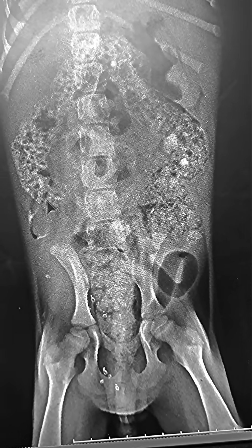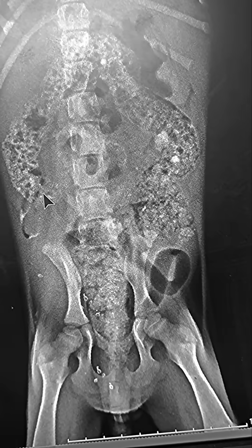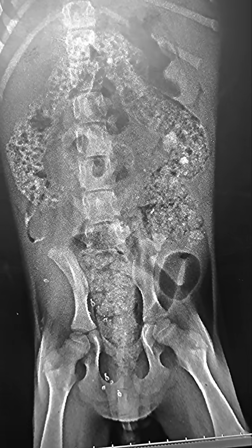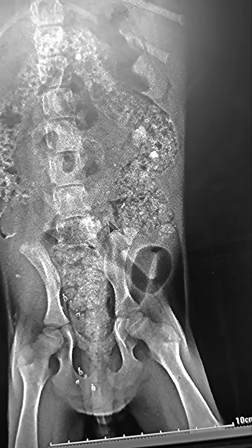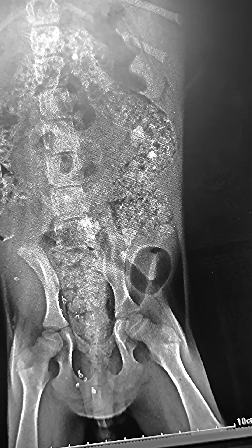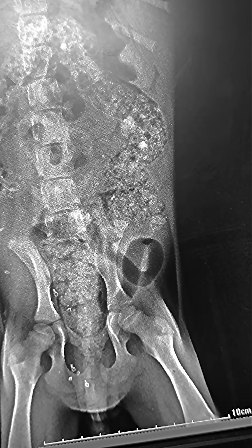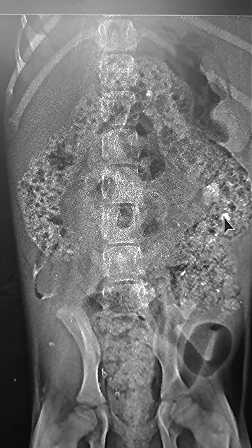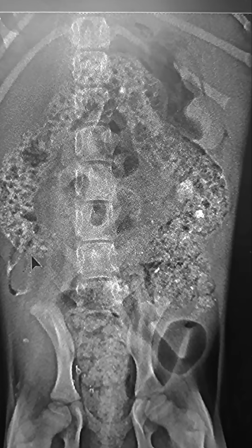If you see here, from the cecum, even gas is not present in the cecum. From here is the ascending colon, this one is the transverse colon, and then this is the descending colon. All of the colon is full of hard pieces. This dog definitely has a tendency to lick mud or soil, and that is why you can see the radio-opaque mineral density in the colon.